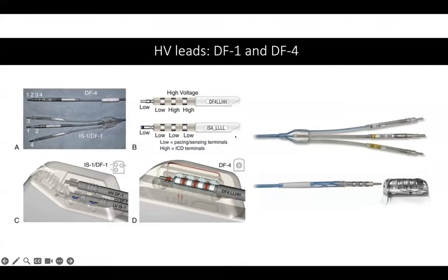So obviously, from Medtronic, from St. Jude, from Biotronik, or any other company, if you have this, the middle is always the pacing port. Am I correct? I don't think you should use that rule, though. I think you should just read whatever is on the label. That's better. The reason I say this is that depending on the company, you can't really predict what is going to happen.